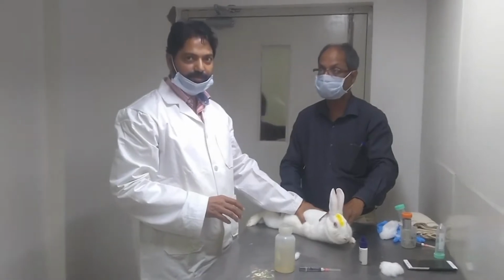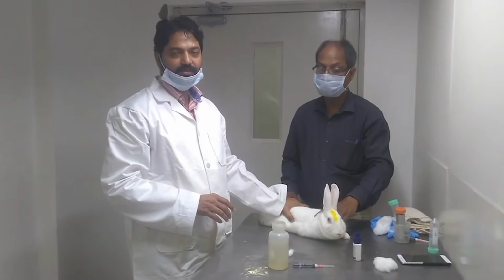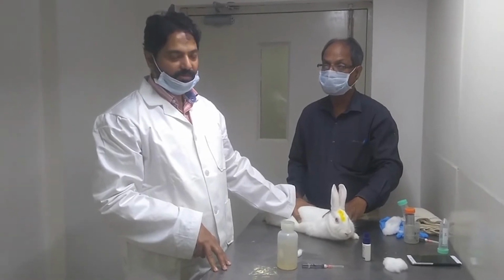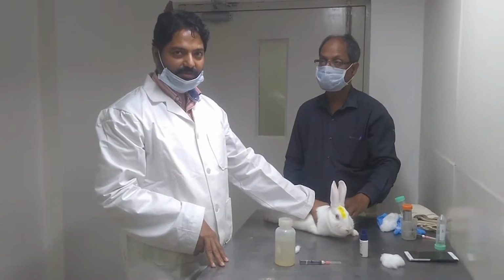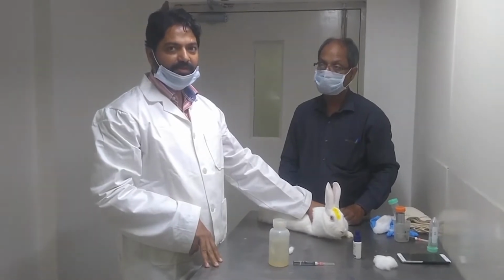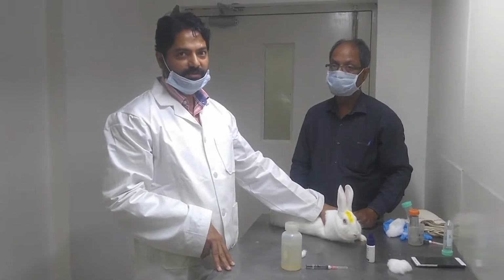Now we are preparing to immunize. The first and important thing in all these animal processes is we have to avoid pain to the animal. For that purpose we have to restrain the animal, because we have to inject. So we restrain the animal in a way that it has less and less pain, and the movement is also less.